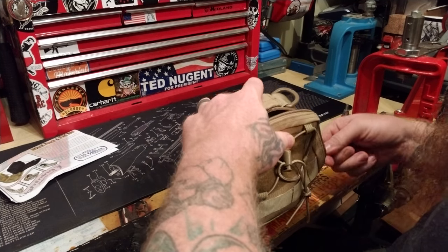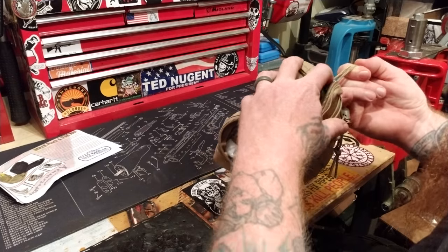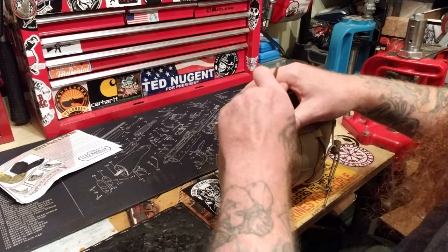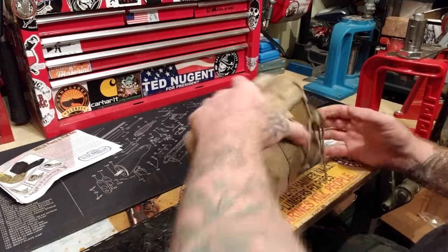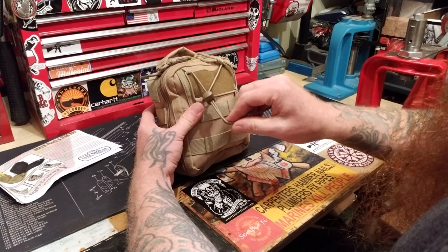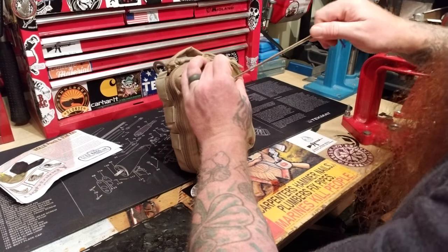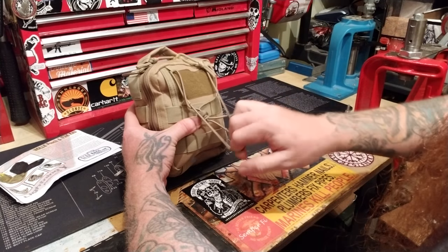I wanted to be able to get to everything, especially the trauma stuff, because you never know what you need first. If it's something minor you won't be rushing, but if it's major you want that trauma gear accessible immediately. Also a cold pack is in there — if someone has trauma, they're probably going into shock, and a cold pack helps.